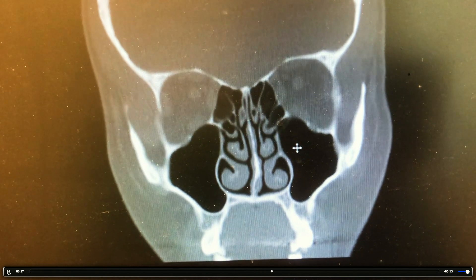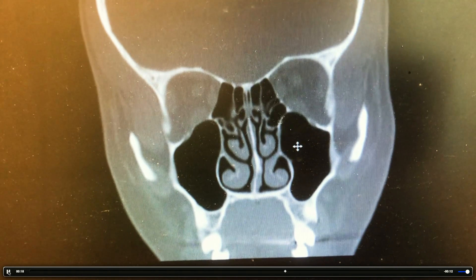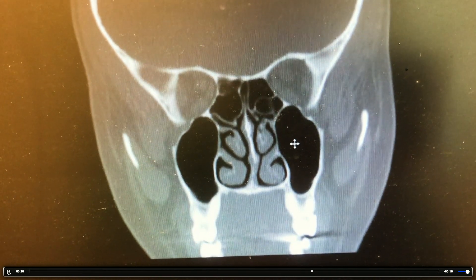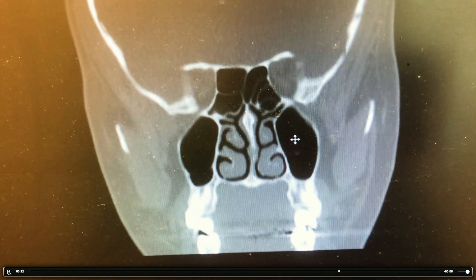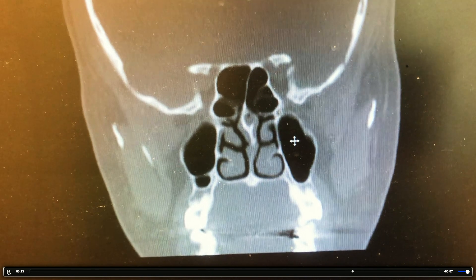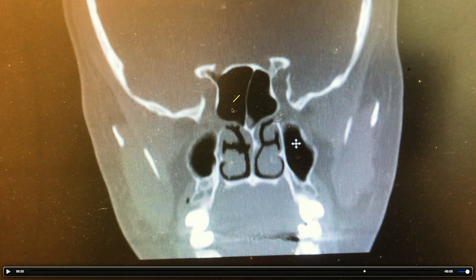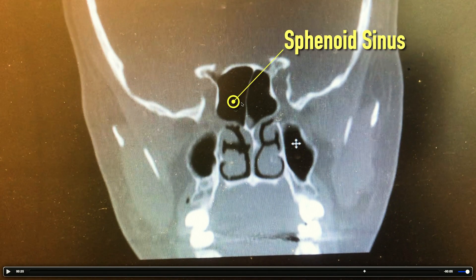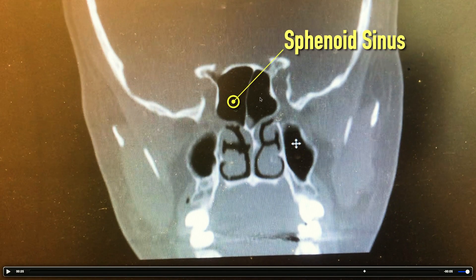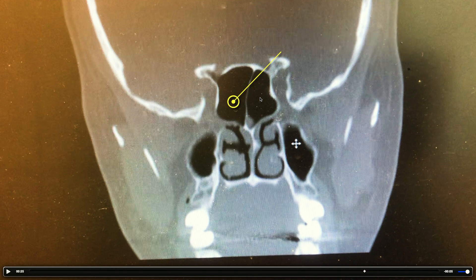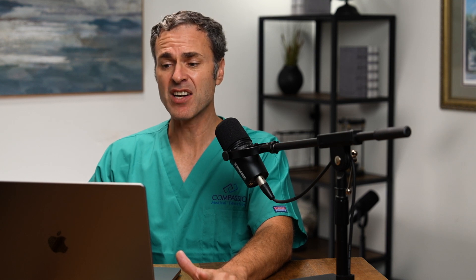And now we're going further back. We're going to find our way into the sphenoid sinus. We're starting to get in there right there. Here's your right sphenoid sinus and here's your left sphenoid sinus — perfectly normal. When ENT surgeons help neurosurgeons doing pituitary surgery, they actually go back here and create the corridor for the neurosurgeon to remove the pituitary tumor.